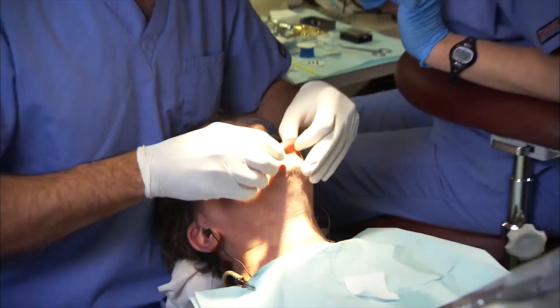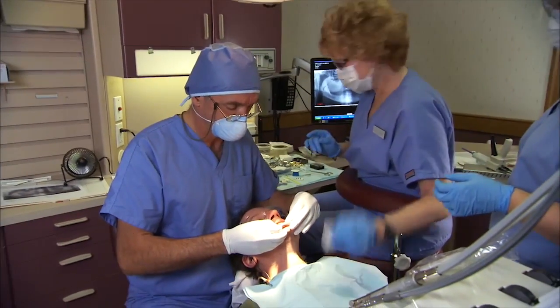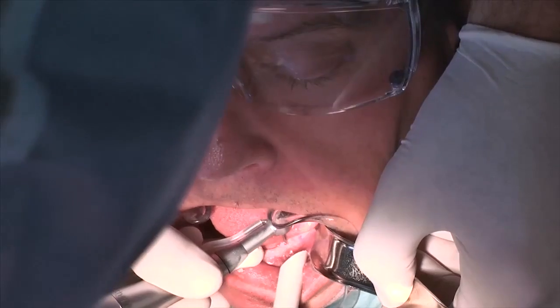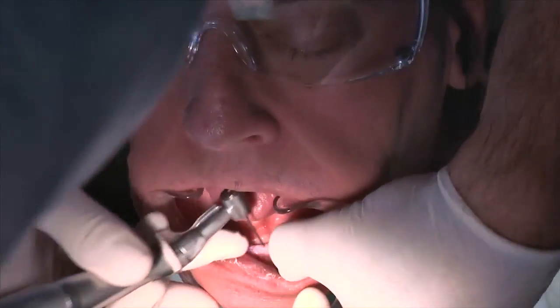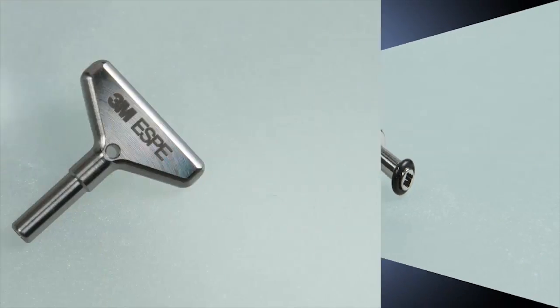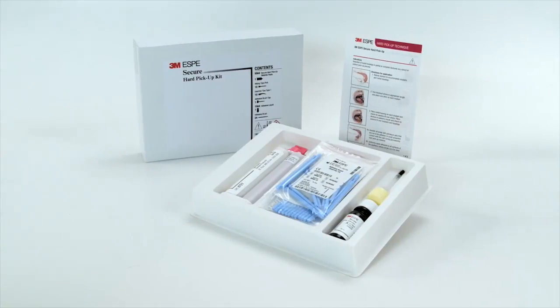MDI Mini Dental Implants can be placed in a dental operatory using local anesthetic. The implant procedure starts with a small pilot hole and does not require a full osteotomy. 3M ESPE provides surgical kits with all the components and tools necessary to start placing MDI Mini Dental Implants in your practice. Most importantly, patients can often use their existing retrofitted denture immediately after the procedure.